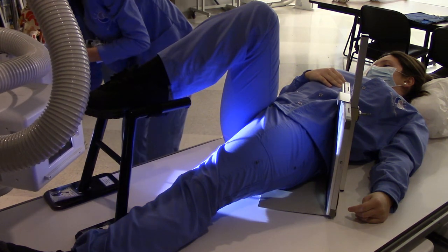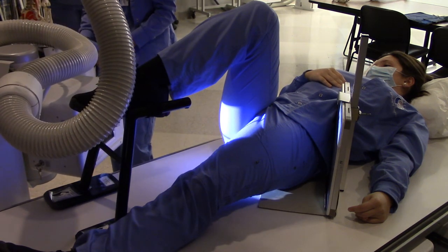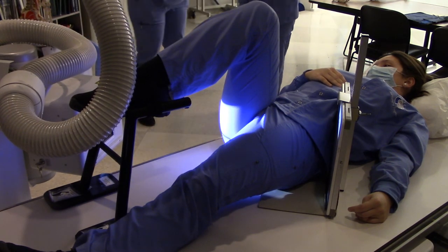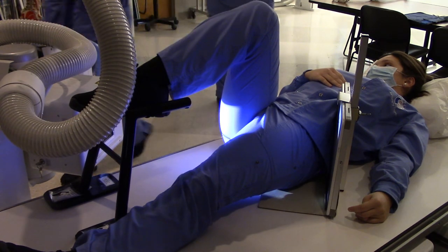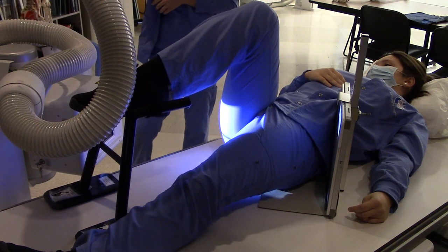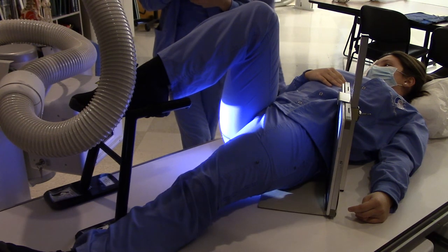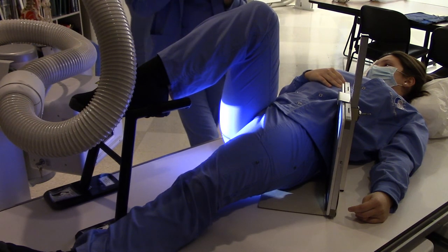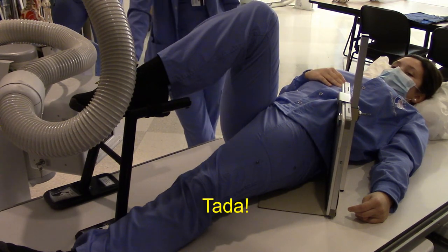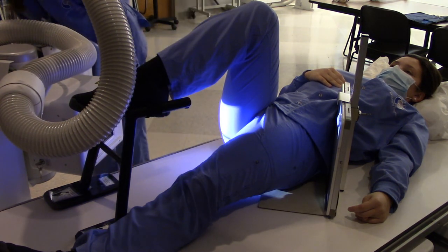Angle it back, hit that blue or purple pivot button. I need to go more over — yeah, like that, there you go. Okay, what do you think Ms. Madison? Take a look. We may not be angled exactly but we're really close — we're good. Alright, very good, cross-table lateral hip. Put your marker right up there, it's still going to be in the light field. Make sure you've got a little bit of light on the table and a little bit of light on the image receptor and you're going to be golden.